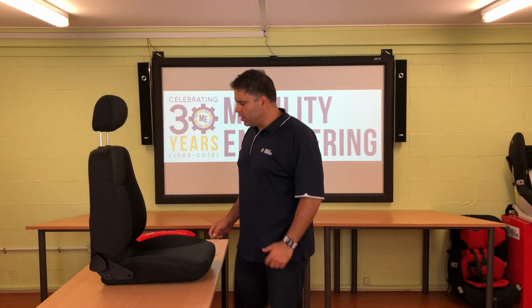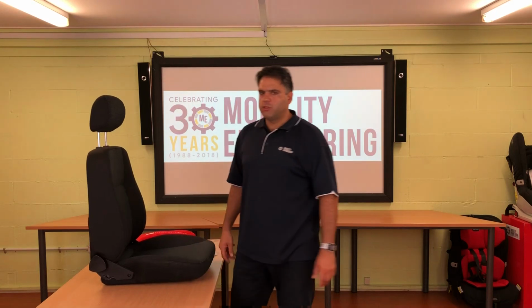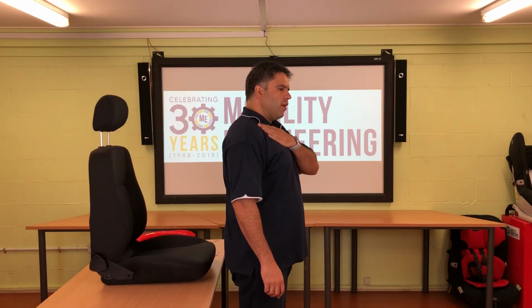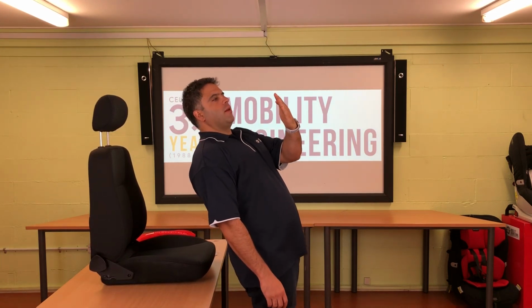So when we are tilting, what we typically find, if I tilt this thing back, one of the issues that I might have is I'll have a seatbelt normally sitting here, and if I tilt back, then the seatbelt might sit out here, and I might be sitting out there. Now, if that's the case, that could be quite dangerous. So we need to make sure that as far as we tilt, the seatbelt still engages on my body, or is still going to safely engage on my body as close as possible in the event of an accident.